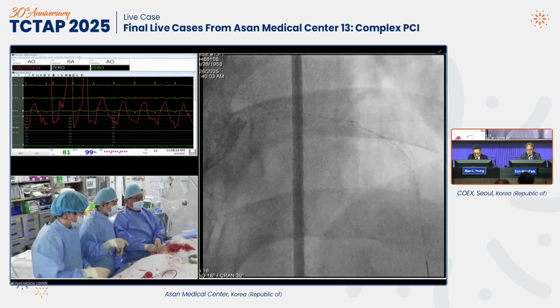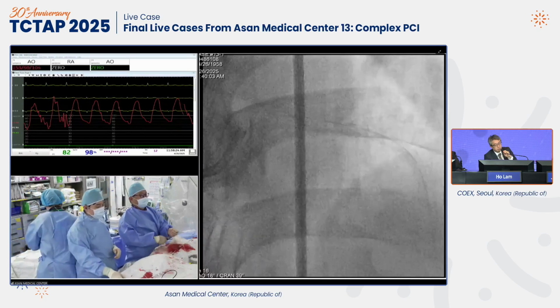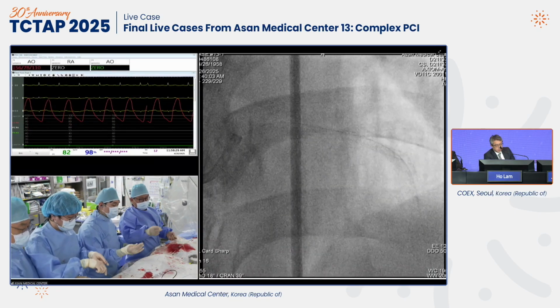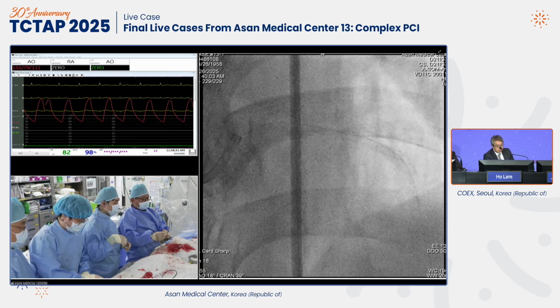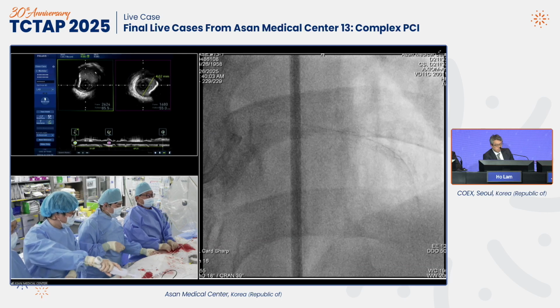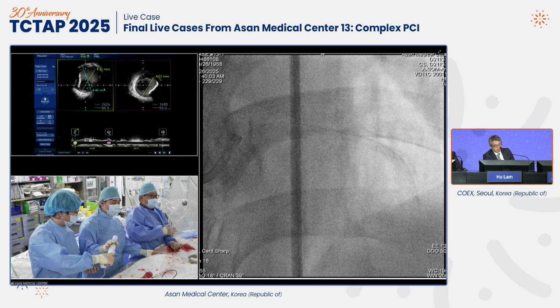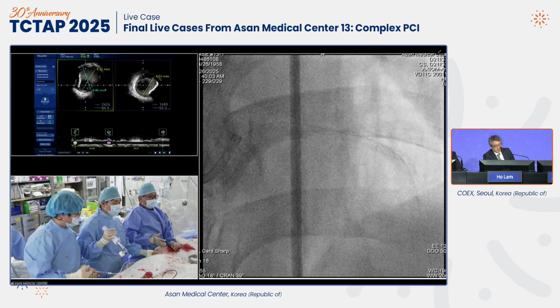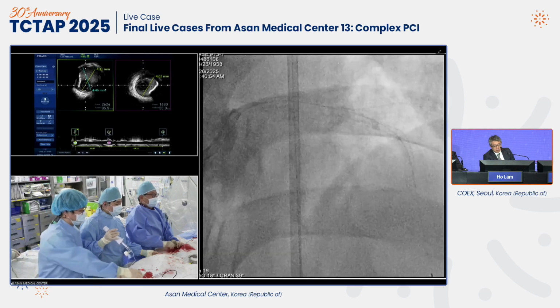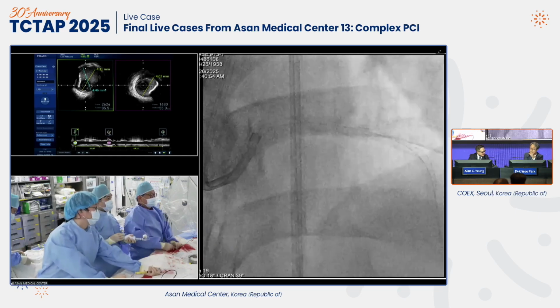Will you consider doing the kiss now before you put the proximal stent? I'd like to do it after the whole stent implantation and do the side branch intervention, to simplify the procedure: the first side branch and second main branch only, and finally do the kissing. And if you do kissing balloon after the proximal main branch stenting, there is absolutely a TAP crush.